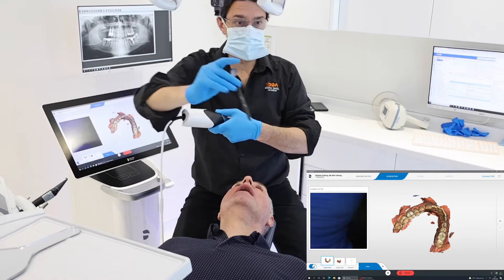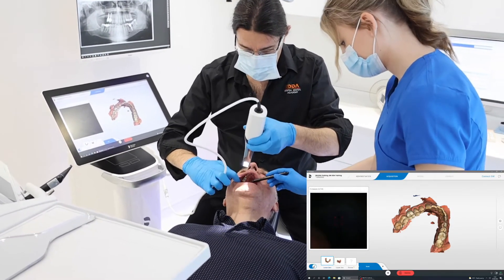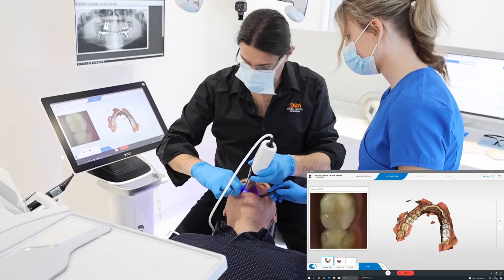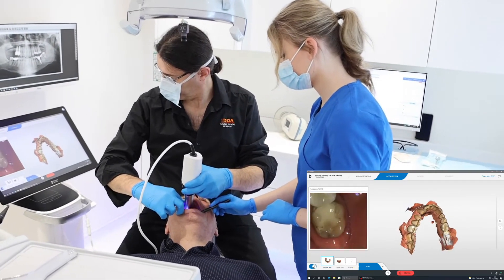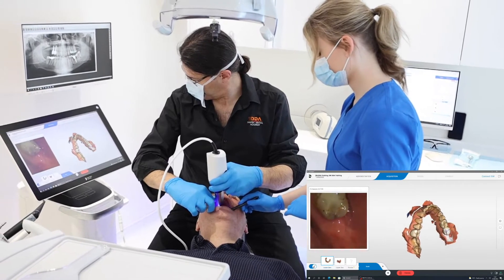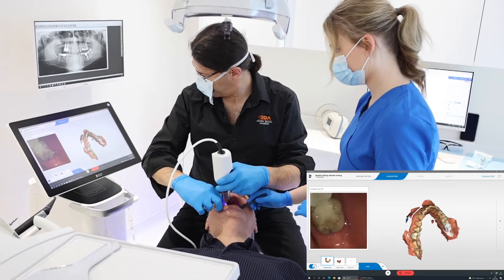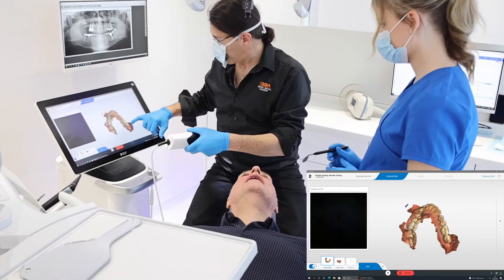We can ask the nurse to retract the soft tissue for us — the tongue is getting a little bit in the way. One of the nice features of the software is it will automatically delete data when you re-scan areas where there might be some data over the tooth.